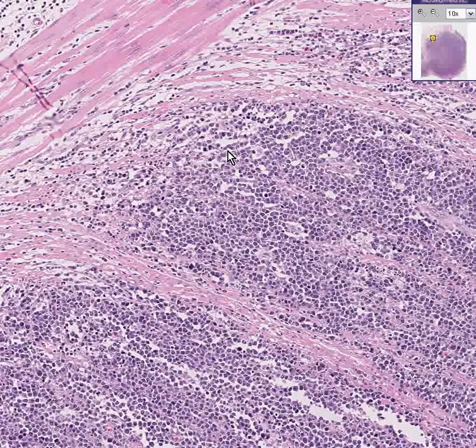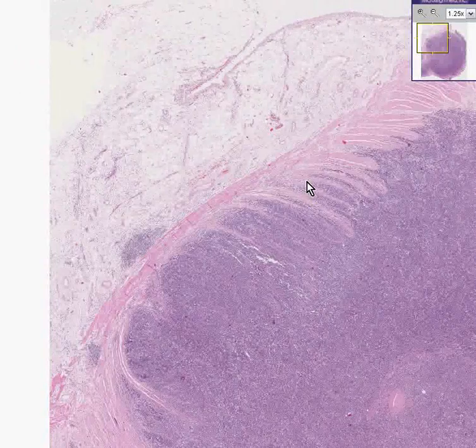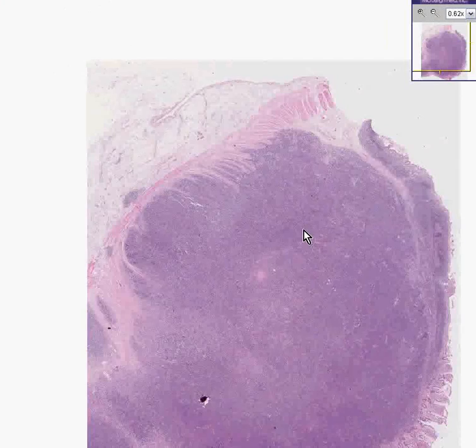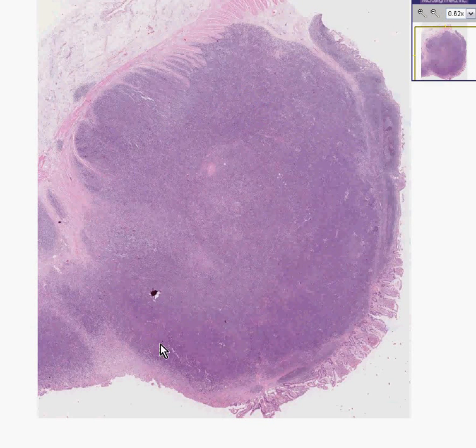And we're going to be getting into a lot of lymphoma cases soon, and I really very much resent the idea that I should try to teach you how to diagnose all the different lymphomas, mostly because I have no idea how to do it myself. Lymphomas are one area of pathology that have been tremendously overhauled and chronically confused people into fear over the years with all the various classifications. But nevertheless, I will say one thing about all the lymphoma cases, including this one.